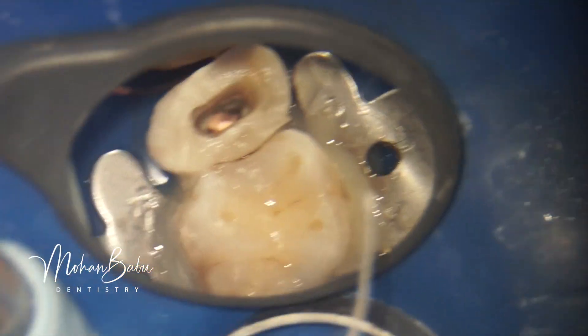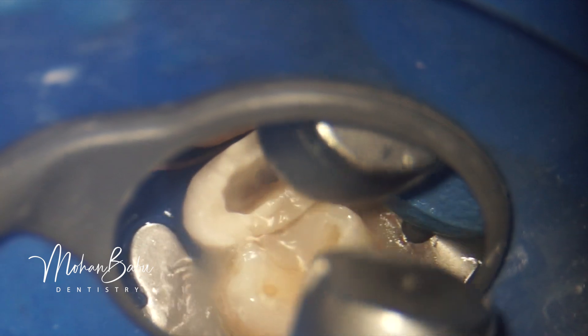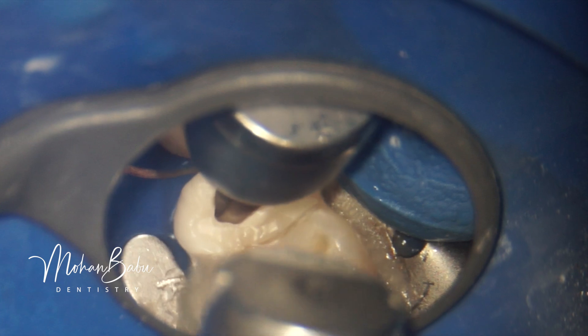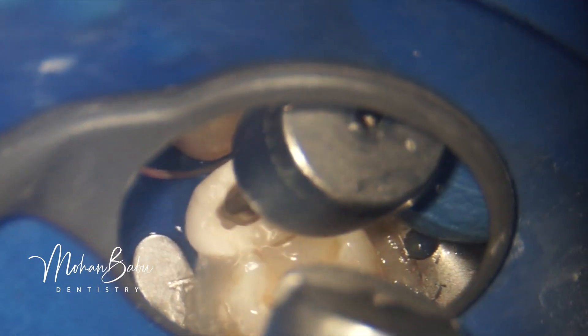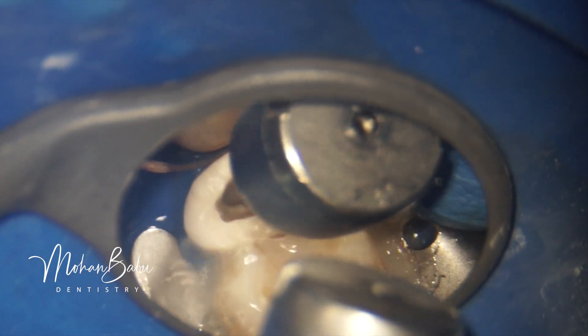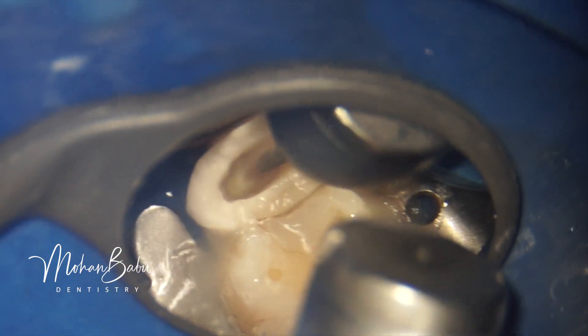To do this, we need a very precise technique and should not damage the remaining tooth structure. The tooth structure is already very minimal, and it is available for bonding with composite material. So we have to eliminate the GIC very precisely. As you can see in the video, we are very gently removing only the GIC and barely touching the dentine surface — the dentine surface is necessary to bond with composite material in the following steps.